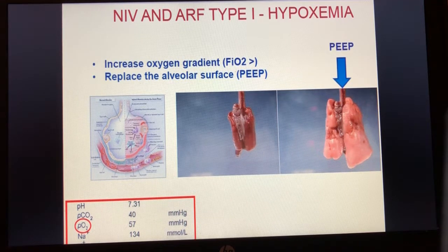By inflating any deflated or collapsed alveoli, this basically makes the lung act less stiff, and therefore the work of breathing required to inflate alveoli that are already inflated, as opposed to collapsed, is much, much improved.